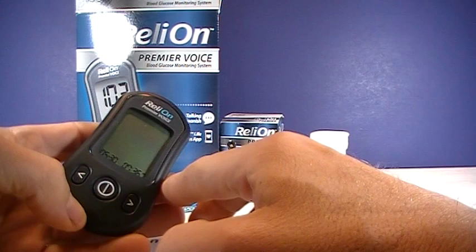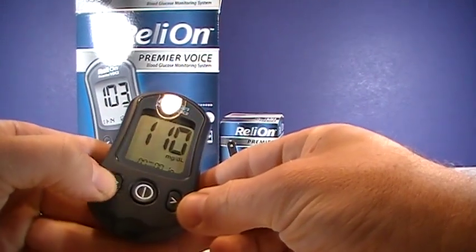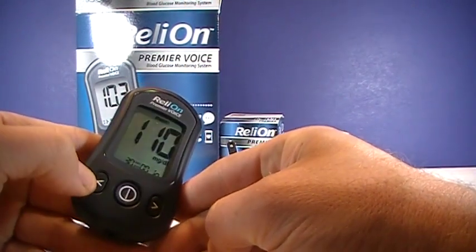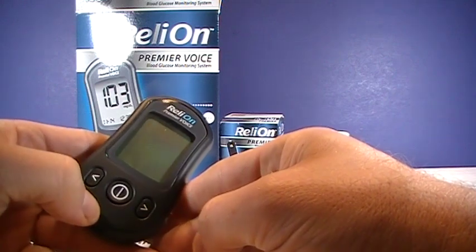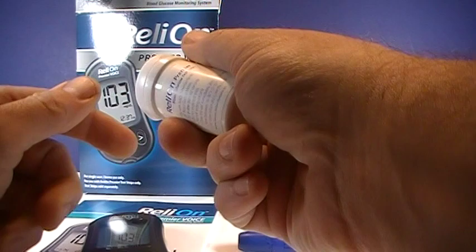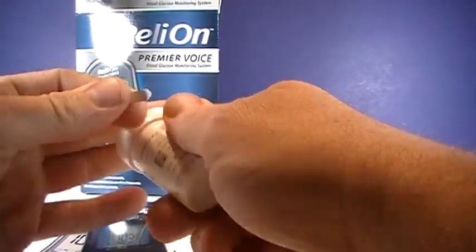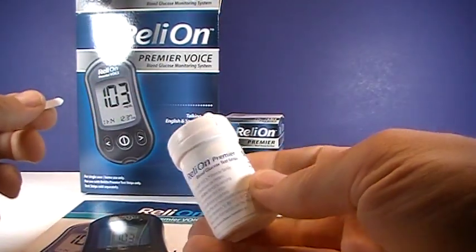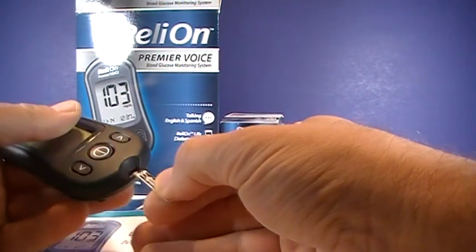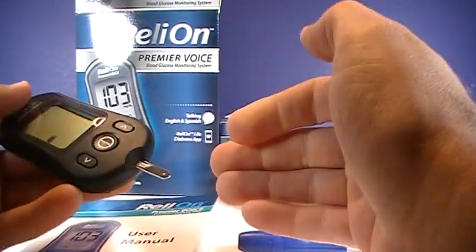You just press the button and it'll go through your historical readings, and can calculate your 7-day, 14-day, and 30-day average. Then you push that again to turn it off. To do a test, you want to make sure you're using the Relyon Premier test strips, and it just goes right into the bottom of the meter.